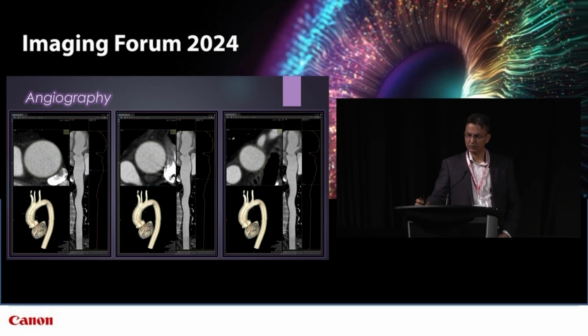So here's a prototypical example of aortic analysis. I've only picked 3 segments. We often give 7 segments because those 7 segments drive the type of surgical intervention that will happen. And that's a fairly standardized template that comes from the surgical literature to drive careful monitoring of each of those segments. The image on the left is the ascending aorta. The middle image is just proximal to the brachiocephalic trunk, and the image on the right is just proximal to the left subclavian artery.